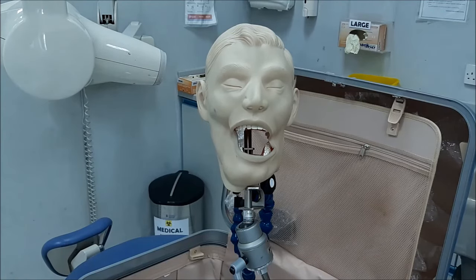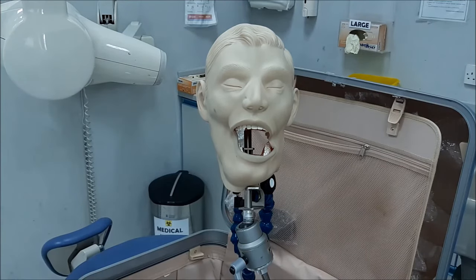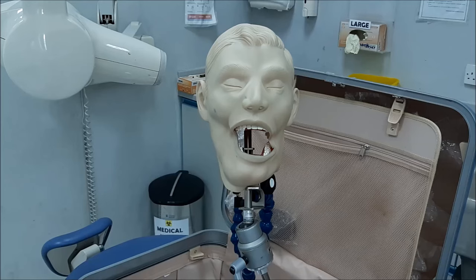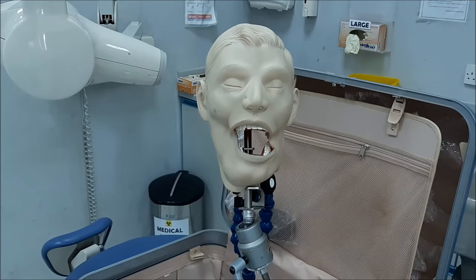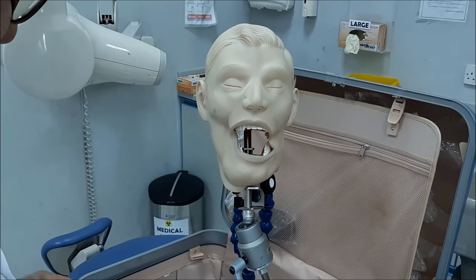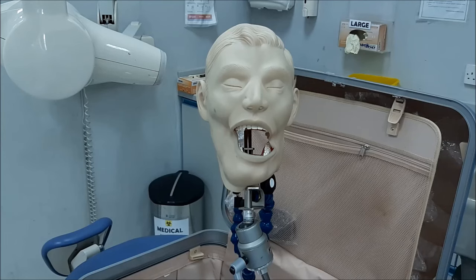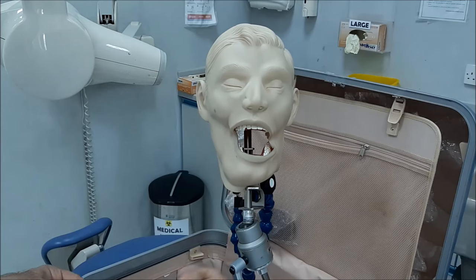The main advantage of the occlusal technique is that you want to see areas not otherwise covered by the smaller coverage areas in periapical or bitewing films. You utilize periapical films and change the way they are placed inside the oral cavity so that you will cover more areas.